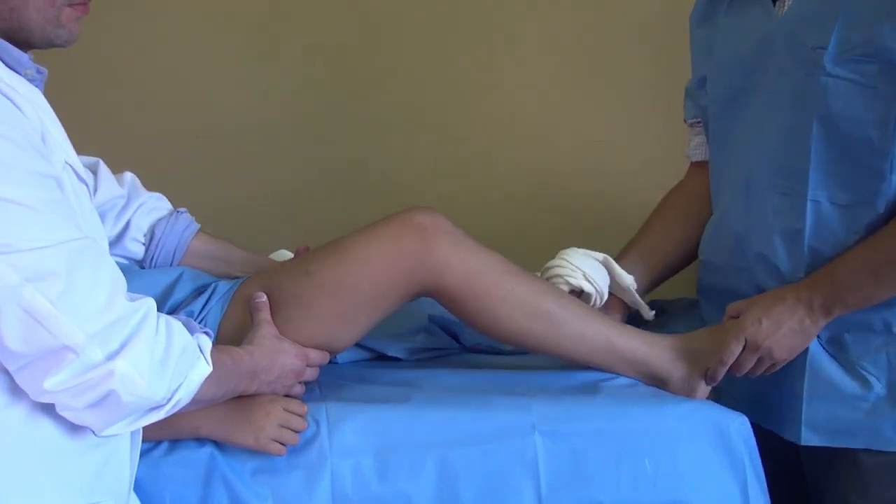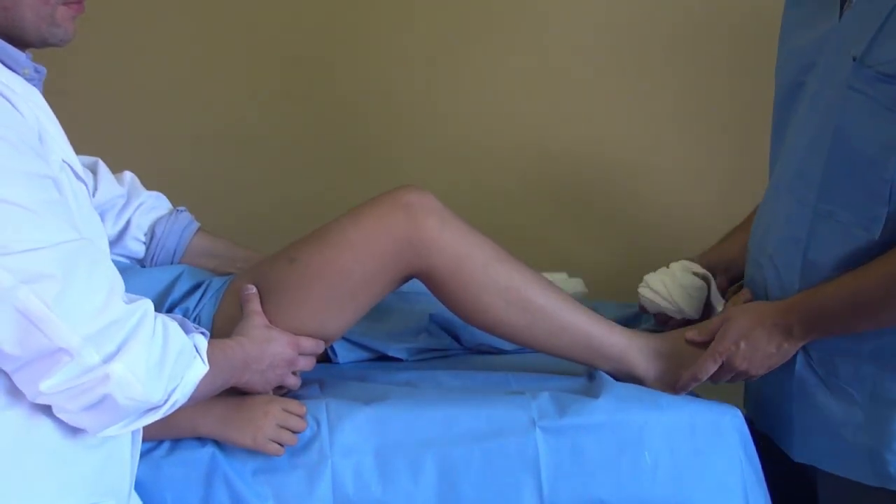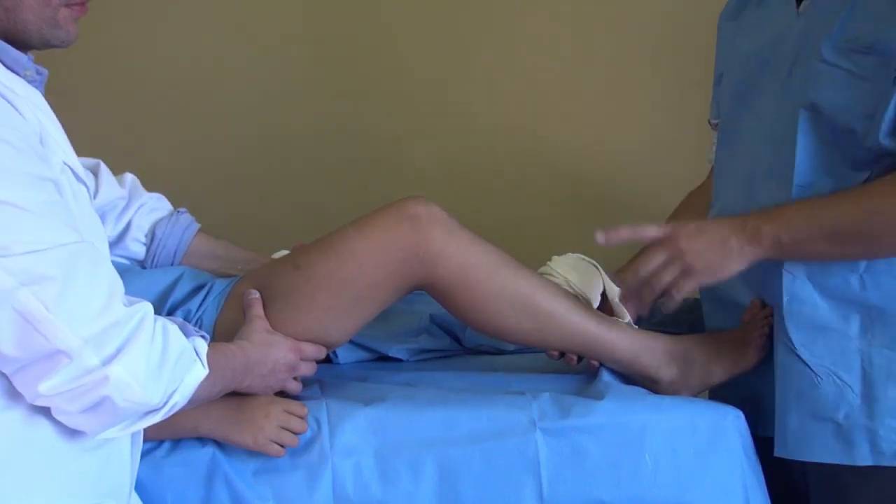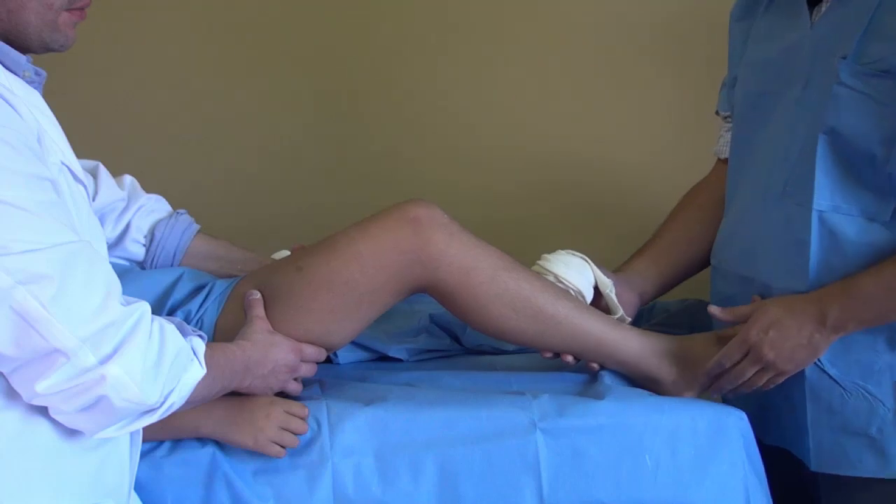We're going to learn how to put on a long leg cast. Here's our patient. You always need one helper to hold the thigh and to help you with the cast.